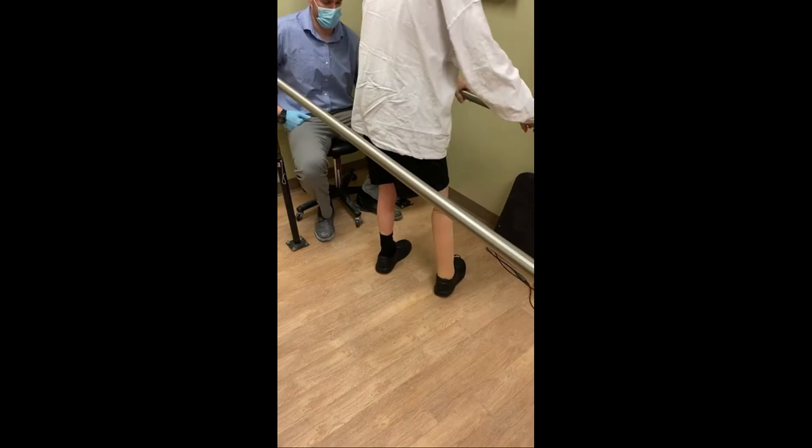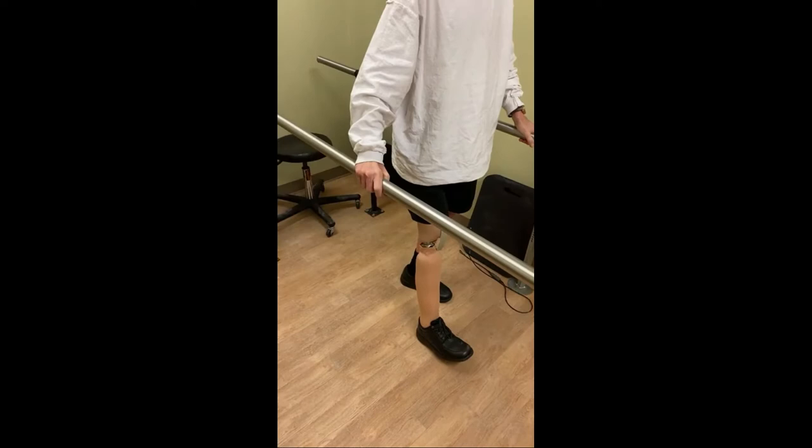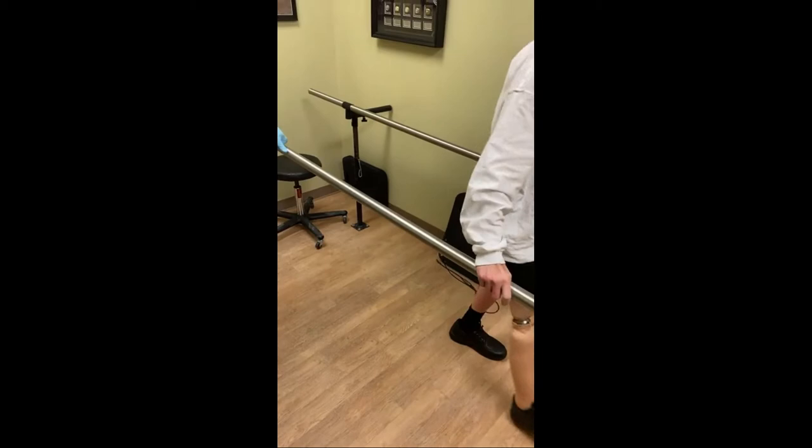March in place. How did that look? Excellent — you did it perfect. What you don't want to do is plant the prosthesis in the ground and twist over the top of it. Just march in place like that — the more steps you take marching in place, that's excellent. Dig that heel in the ground, drive that foot back. Good. Pull yourself over.